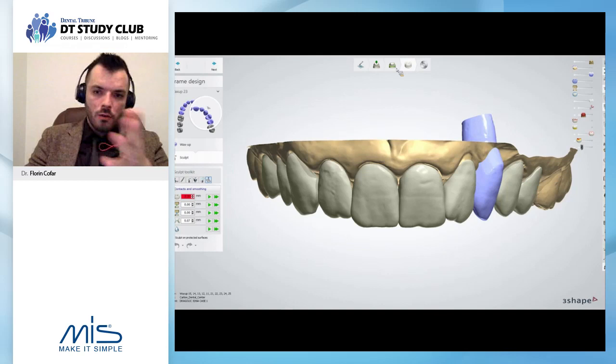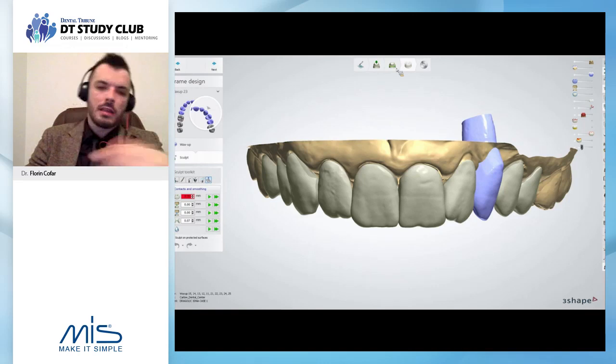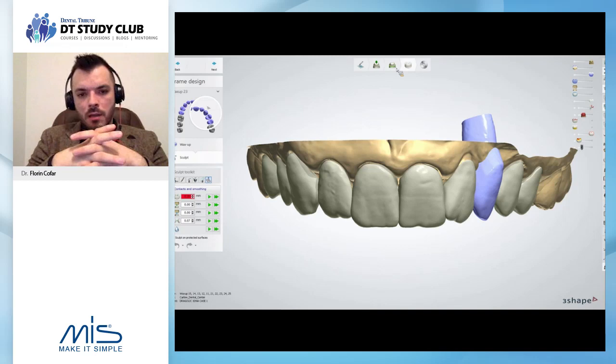And again, what you see is different from what we were doing in analog. In an analog way, we would usually place the implant and then restore the entire case. Now, because we can control geometry completely, we're starting to think the opposite way.